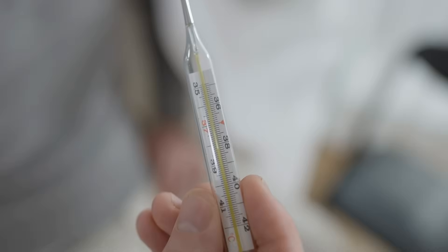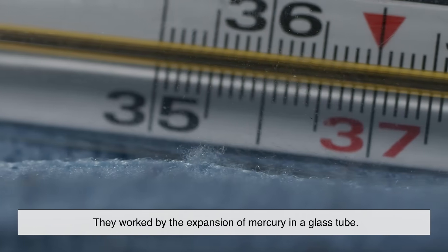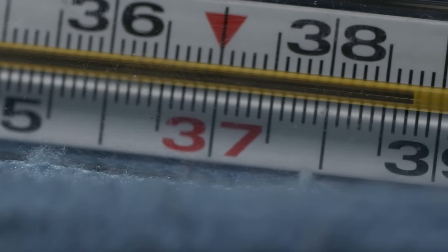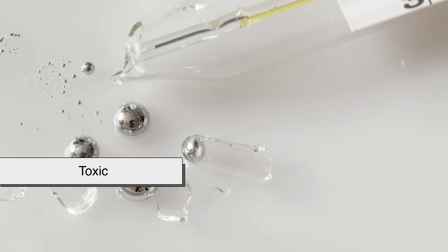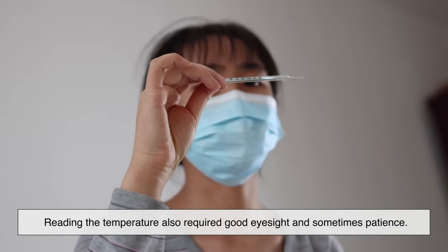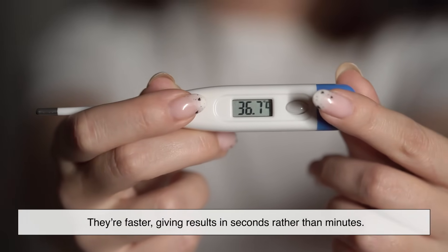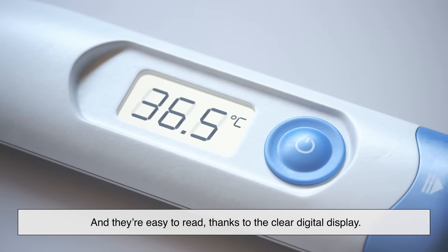For decades, mercury thermometers were the standard. They worked by the expansion of mercury in a glass tube. While they were accurate, they had several downsides. Mercury is toxic, and a broken thermometer can be dangerous. Reading the temperature also required good eyesight and sometimes patience. Digital thermometers solved all these problems: they're safer because they don't use mercury, they're faster — giving results in seconds rather than minutes — and they're easy to read thanks to the clear digital display.